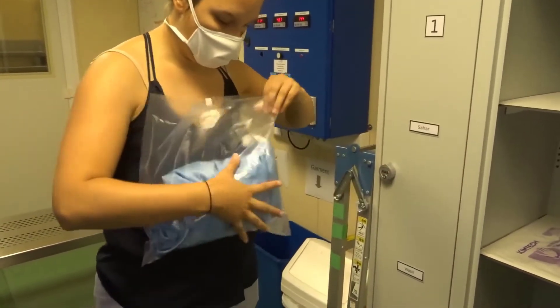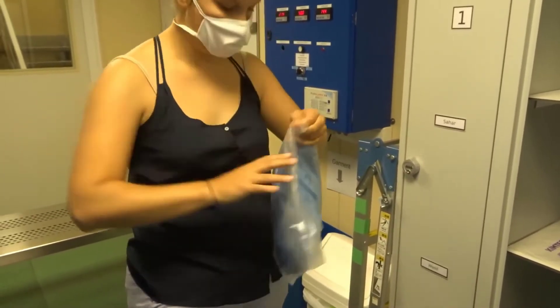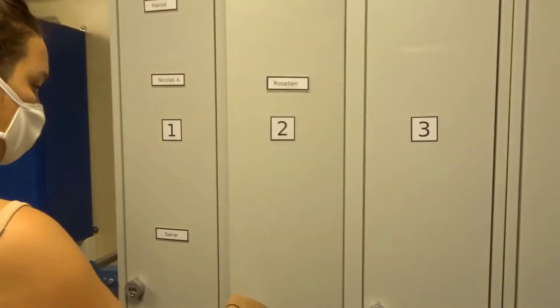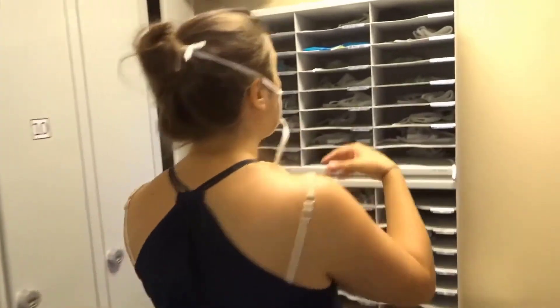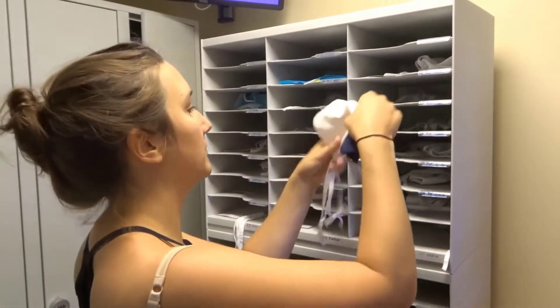At the end of the week, all lockers will be emptied and names removed. You can now exchange your face mask to exit the cleanroom, as usual.